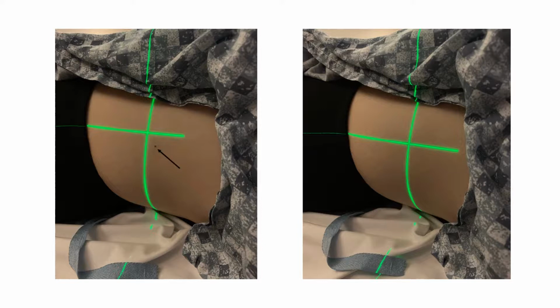Once the therapists have aligned you to your marks, it is very important to hold still, as imaging is about to begin. Even though the outside of your body is now aligned, we also want to see what is happening on the inside.